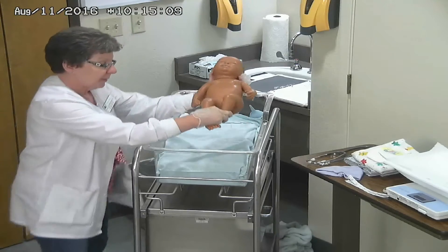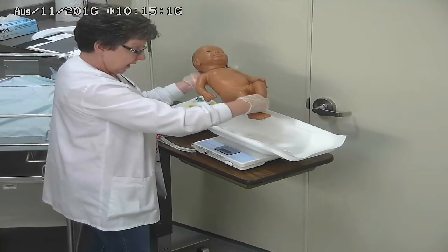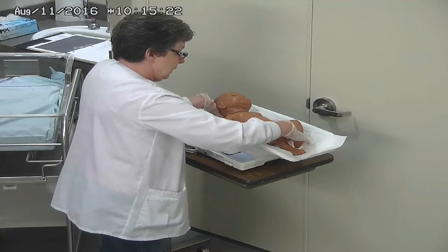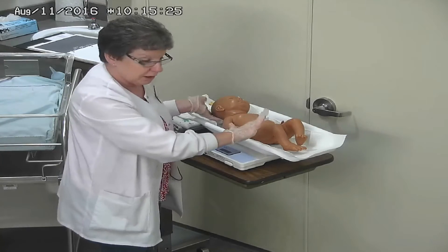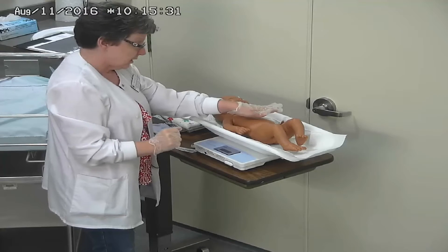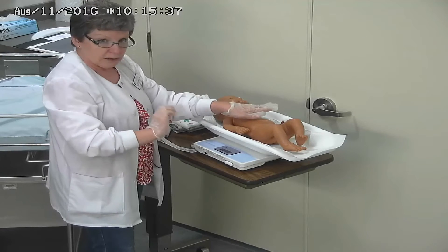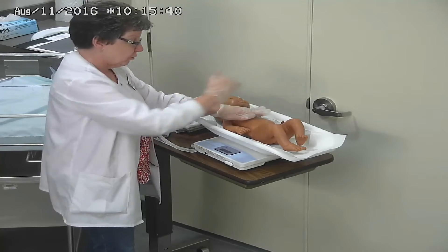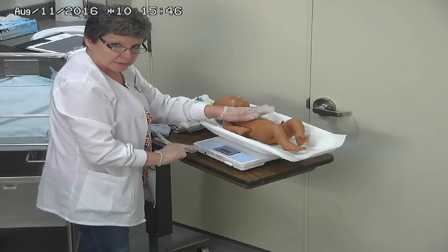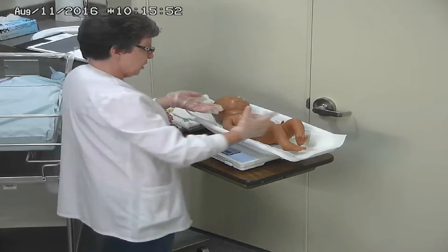I'm going to pick my baby up carefully and bring them over. Prior to this, I have placed a cloth over my scale and zeroed it out. I lay the baby carefully — even though there's a lining over the scale, it is very cold and these babies will startle easily. I always keep my hand over the child at all times, because it only takes a split second for that baby to flip out. We're going to weigh in kilograms, and then switch it over to pounds so parents know how much the child weighs.